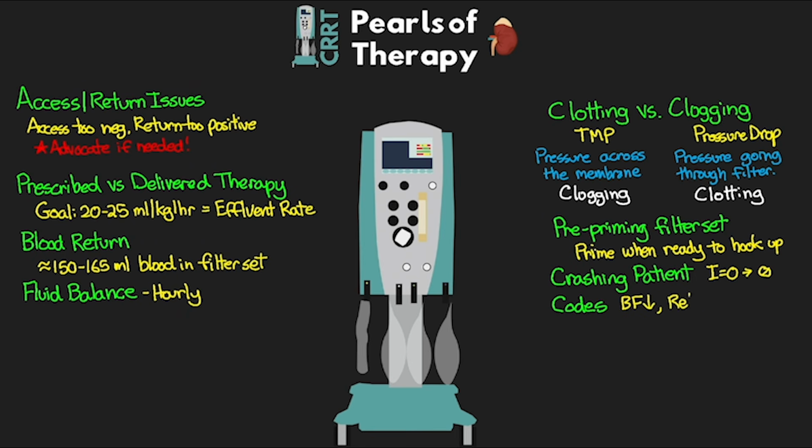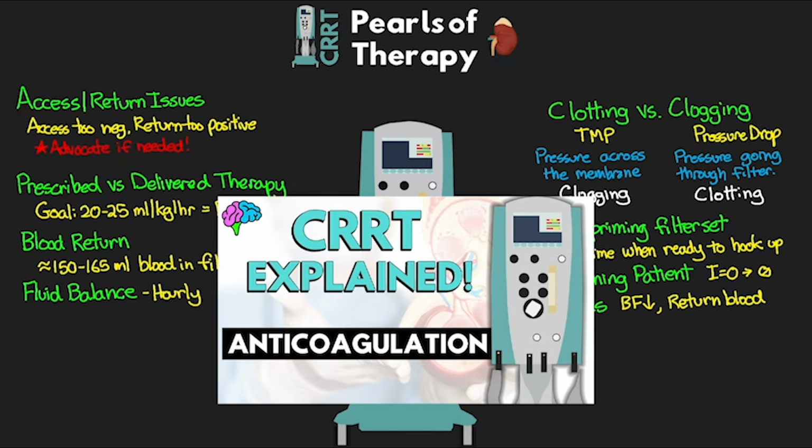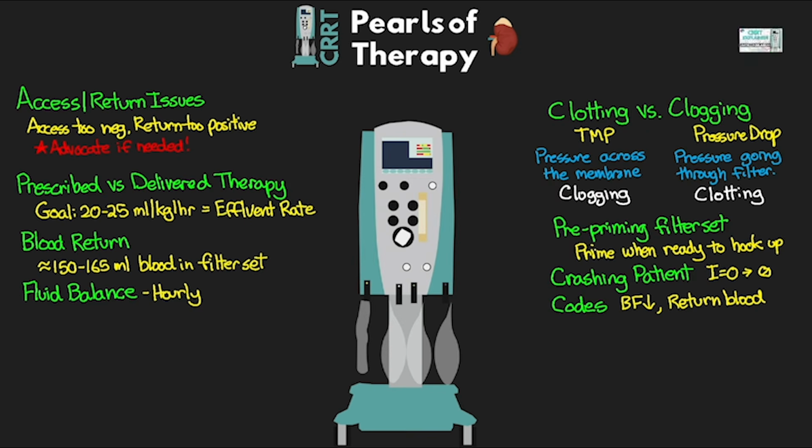And really, as soon as you get the chance, you want to return that blood. Because really, compressions and CRRT running smoothly do not go together. The last thing you want while your patient is coding is to be constantly dealing with the CRRT alarming.